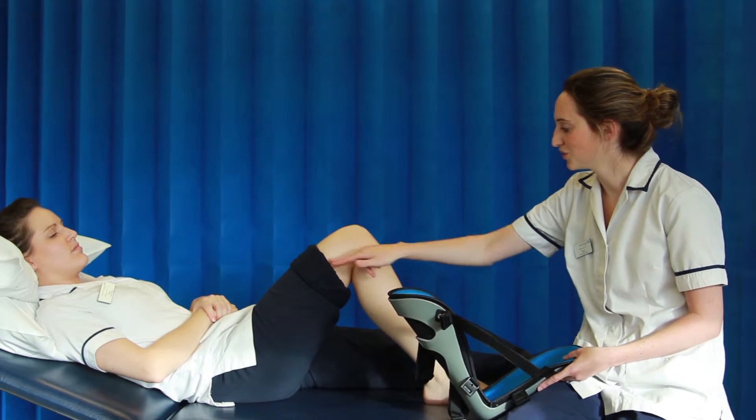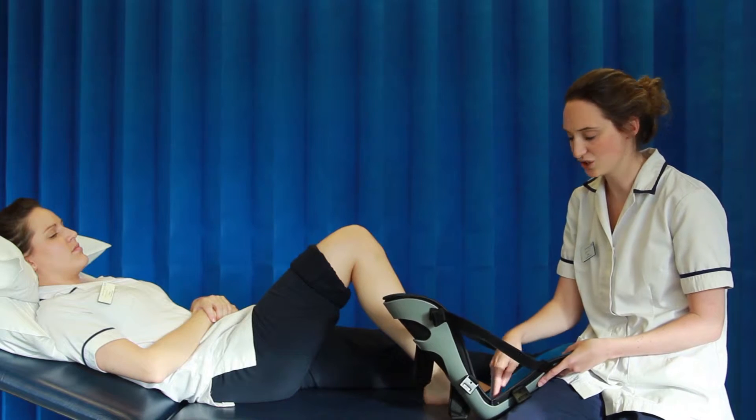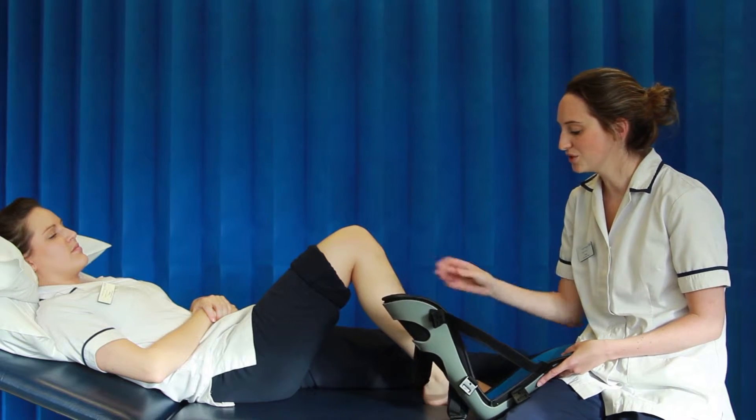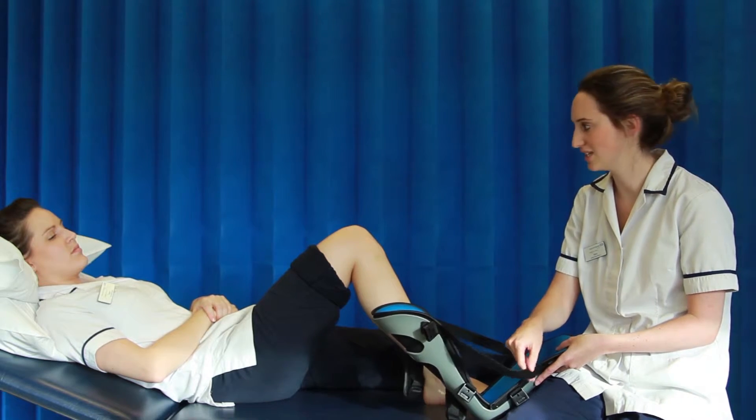Before applying the splint, make sure that the leg is in a bent position, as this will allow you to get the heel into good contact with the splint. Also make sure that all of the straps are undone, especially the side straps, as that will become important later on.